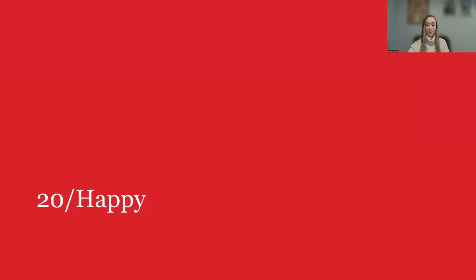Again, 20 happy is what we call a patient who has clear and comfortable vision. This is our end goal for every refraction, and it's up to you to help your patient determine what is most comfortable for them. Even if they're 20/15 in the phoropter with their full cylinder correction, they may feel more comfortable with reduced cyl correction in trial frame, even though they're only seeing 20/20 in both eyes. So you always want to go with what provides the patient the most comfortable vision.